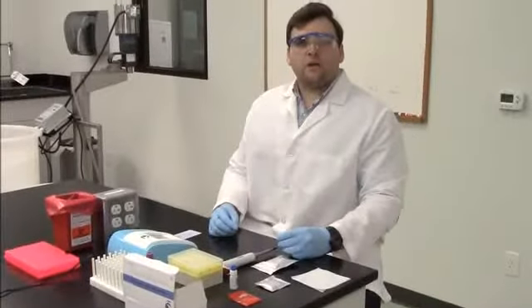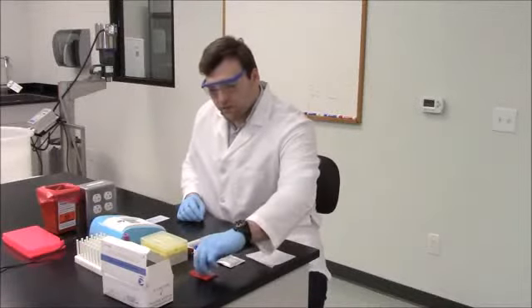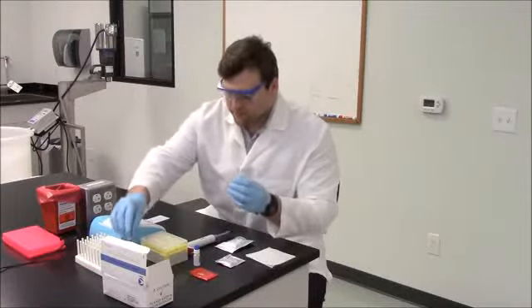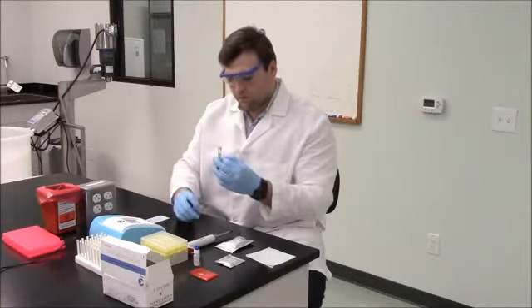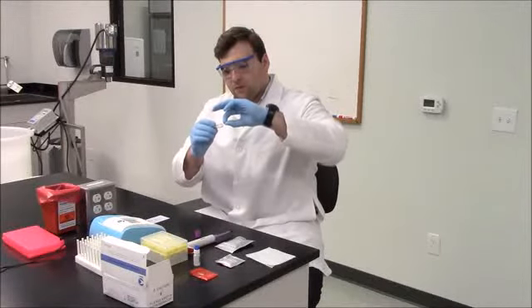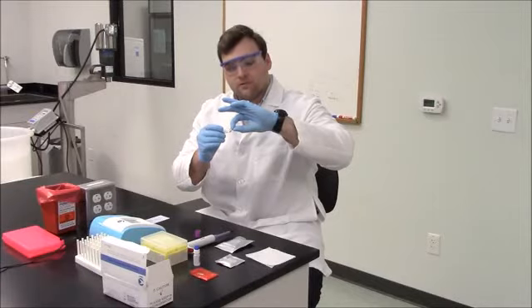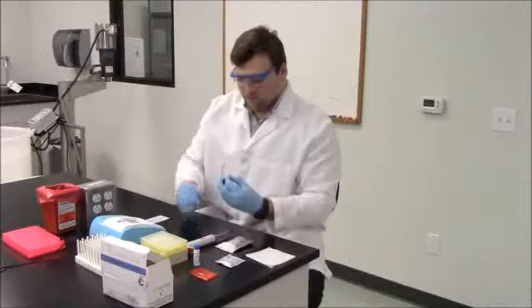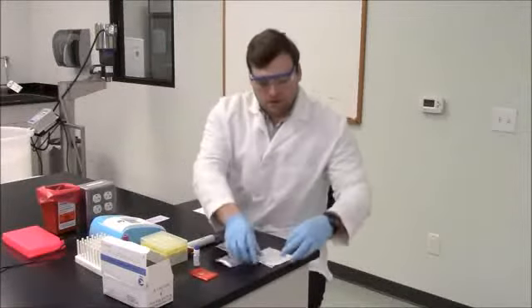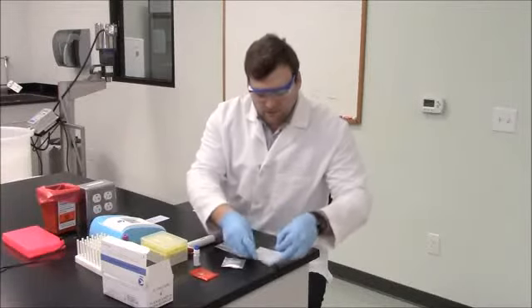Now I will show you how to run a test. To begin testing, 5 microliters of sample must be obtained in a capillary. While obtaining your sample, make sure that the blood reaches the end of the capillary tube. After obtaining your sample, be sure to wipe off any excess blood around the edge of the capillary.